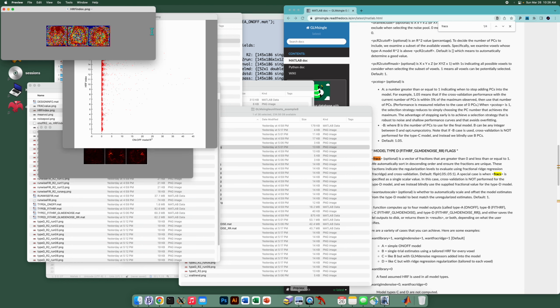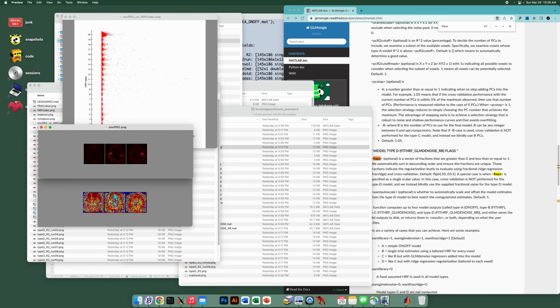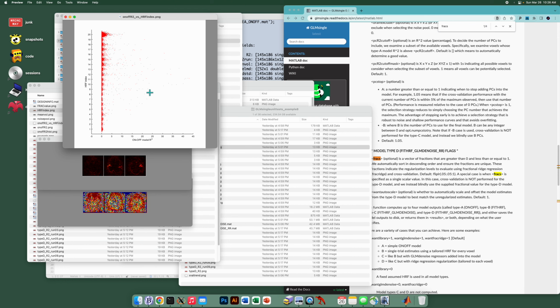So as we saw earlier, it's a little tricky to see the relationship because there's very few voxels that have any signal, according to this view. But if you look at this scatter plot, it's essentially these voxels, which are very small. This was deliberate because some data sets may have many voxels. But if you look carefully, there are voxels that achieve very high r² corresponding to these regions here. And the HRF index selected for these are roughly in this range, between 9 and 16.